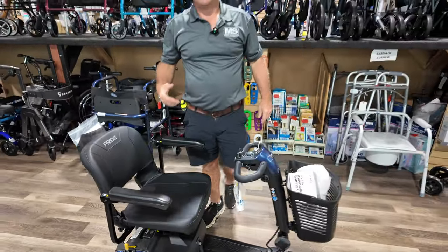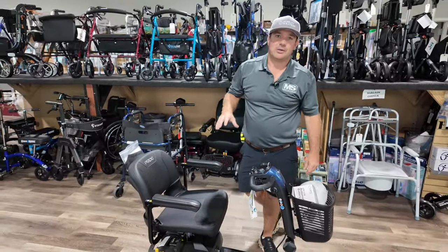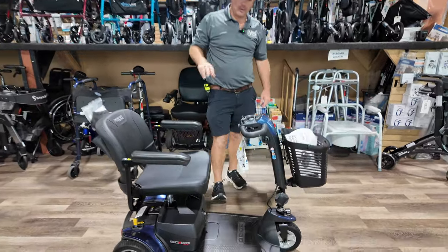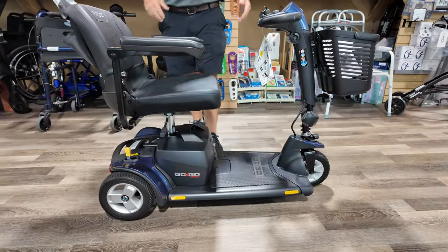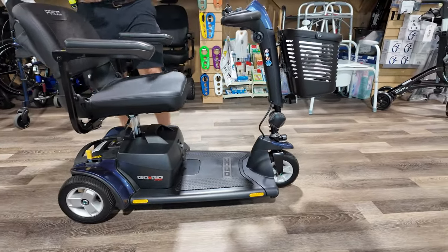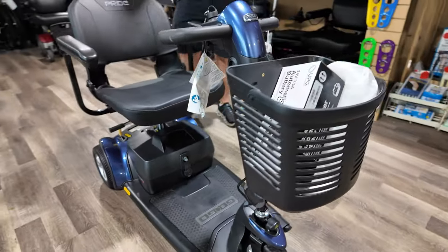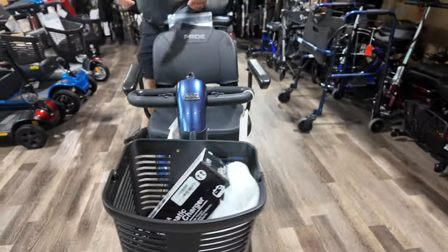Hey, I'm Chris with Mobility Solutions, affordablemedicalusa.com, and I have the GoGo Sport three-wheel. This also comes in four wheels. This is one of the most popular scooters in the GoGo series. It's going to have a 325-pound weight capacity, which is a little bit better than the other GoGos, and it will come standard with the bigger batteries.